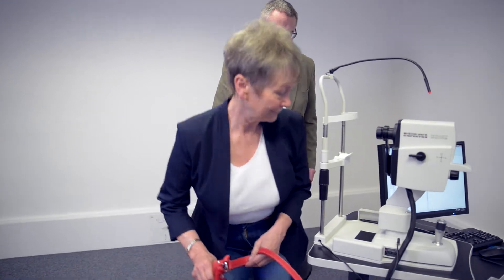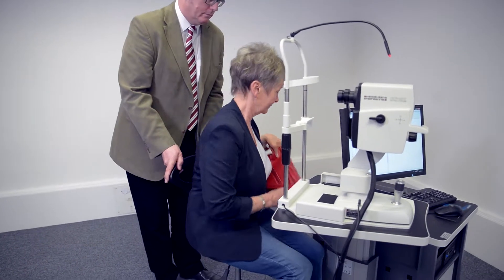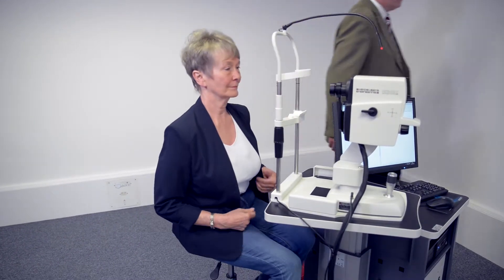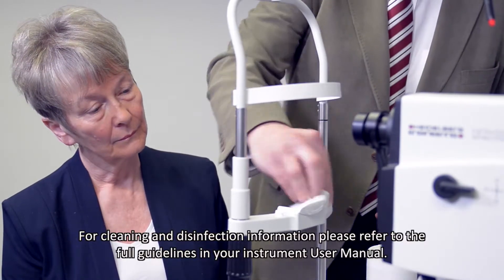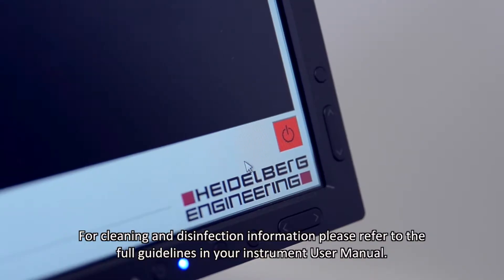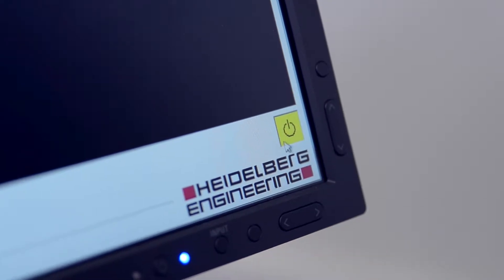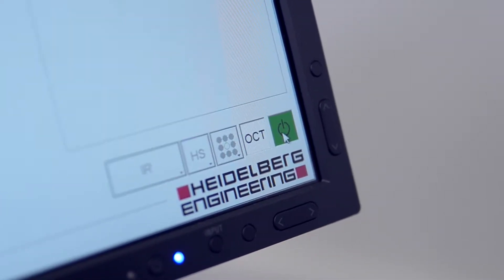After welcoming the patient, the patient should be seated at the Spectralis instrument and the headrest cleaned in accordance with local infection control policy. The patient details should be entered into the HEYEX software and the image acquisition module started.